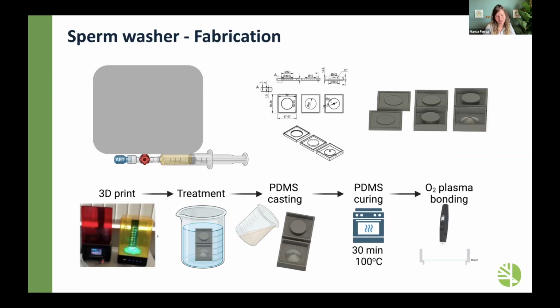So if we were going to do the normal, more conventional way, it would be so expensive and not possible. While with 3D printing, we can change the design in the same day, have a mold ready and a device ready to be tested. So that's why we chose to do 3D printing.